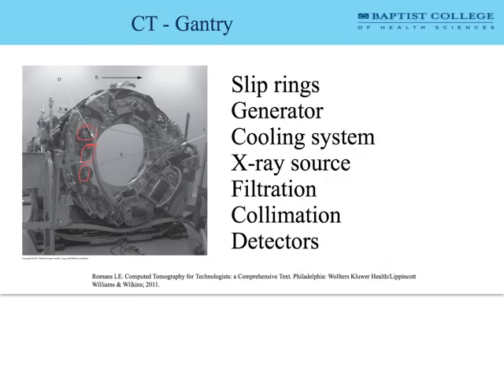Moving along to filtration, the part that I think is important here is that filtration is going to allow us to create a more uniform range of diagnostic energies, so it's going to get rid of those weak energy ranges. And if you look at the bottom of that first paragraph on filtration, it talks about creating a more uniform beam intensity, so it will improve the image by reducing the artifacts that result from beam hardening.